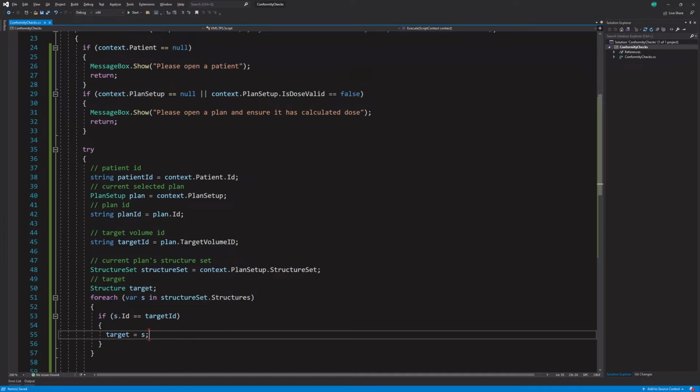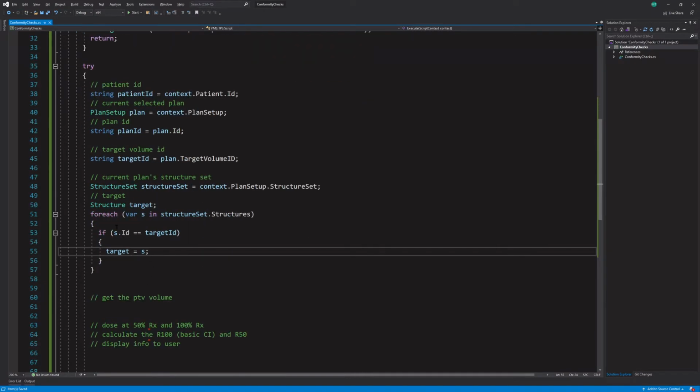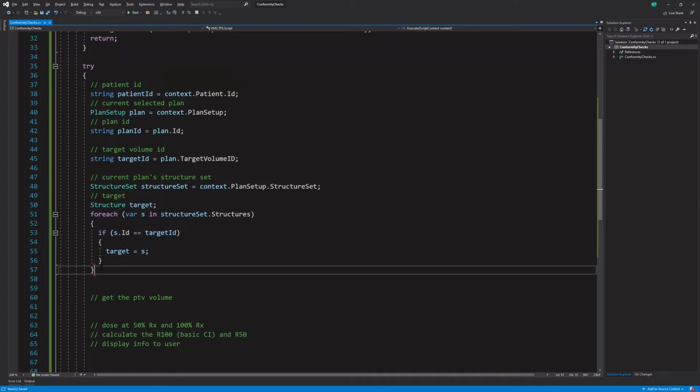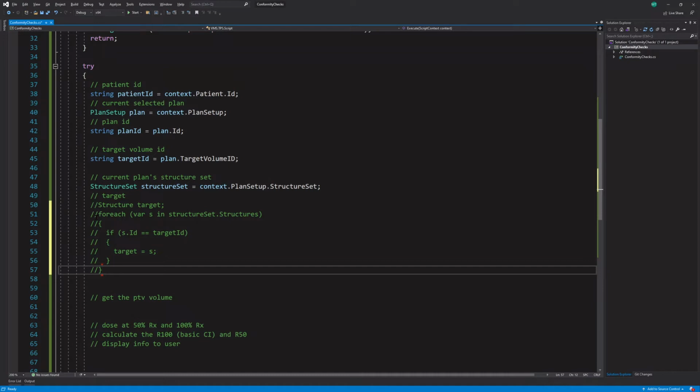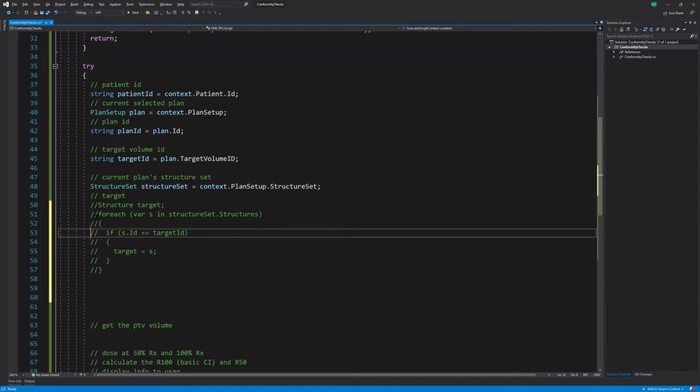Okay. So foreach, it's going to loop through all of the structures that are in the structure set, and it's going to check each one and say, for each structure, does the structure's ID equal the target's ID? And if it does, then we want to set the target equal to that structure. Okay, so this is the long way that you could do this. All right, so I'm going to comment this out, and I'll comment this out as well. That way, you know, that's all together. And we'll say target long way.